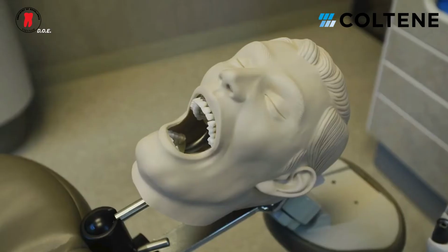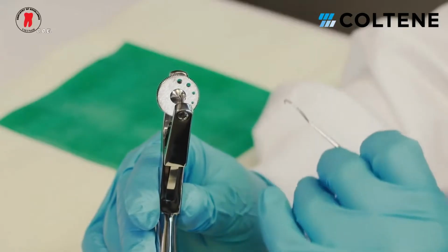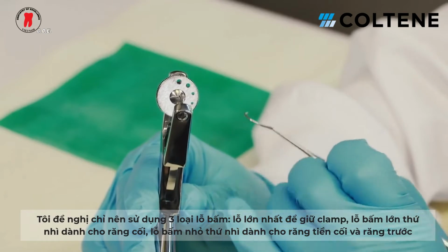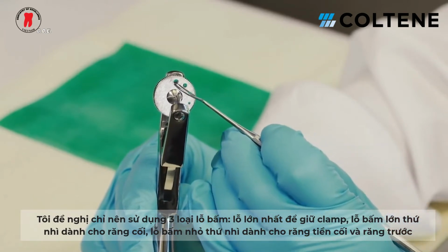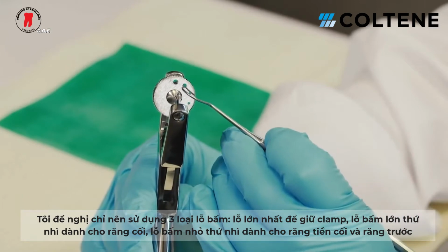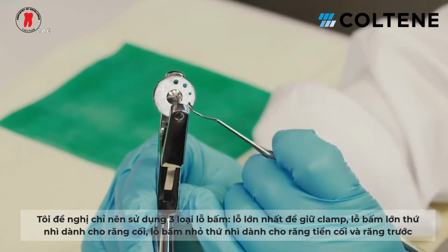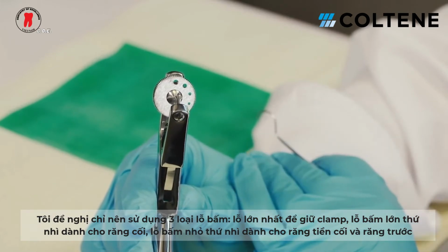When it comes to perforating our rubber dam using the Ainsworth rubber dam punch, I recommend selecting only 3 sizes of punch holes. The largest for the retentive clamp, the second to the largest for every molar, and the second to the smallest for every premolar or anterior tooth.